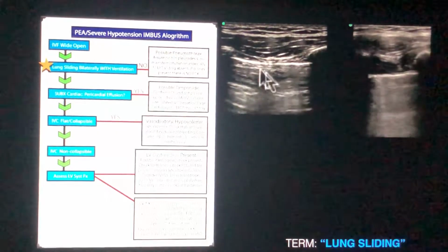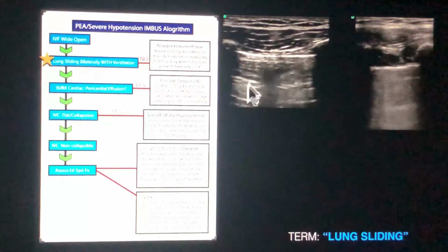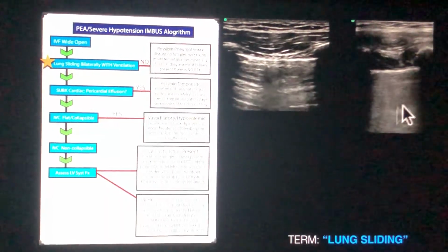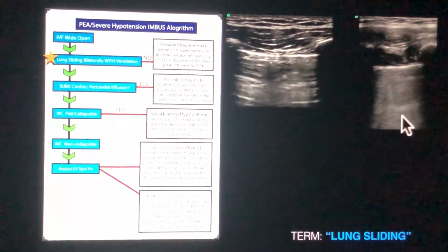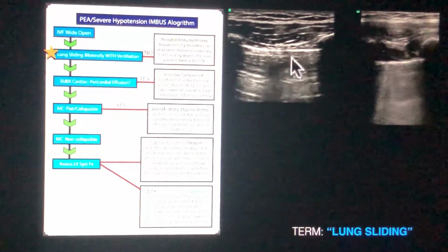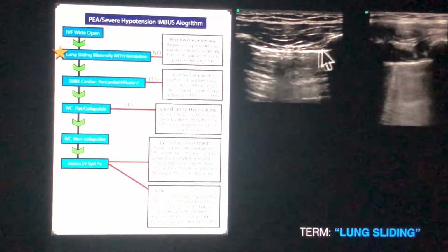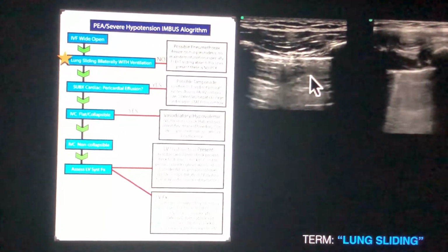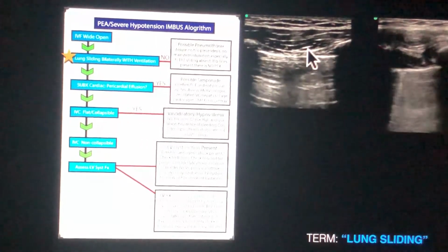In addition, the reflection below this white line is a really beautiful reflection of what's up above it, compared to sort of this, looks like an old black and white TV that got unplugged, kind of noise on this right image. So this is what pneumothorax looks like, a lack of lung sliding and typically a pretty reflection below that white line of what is up above.